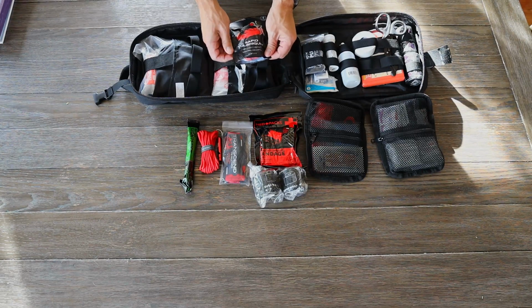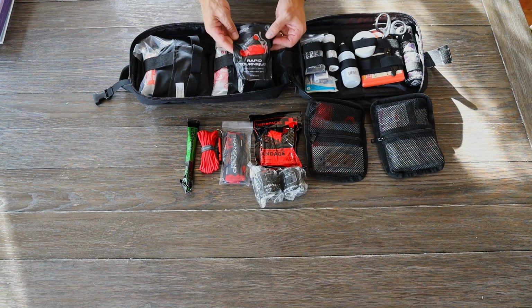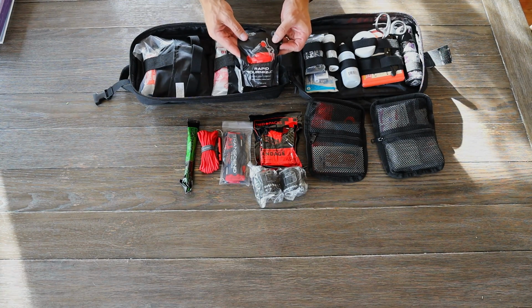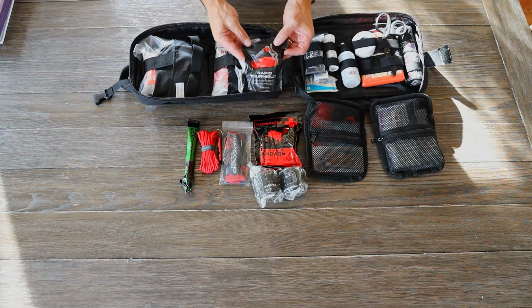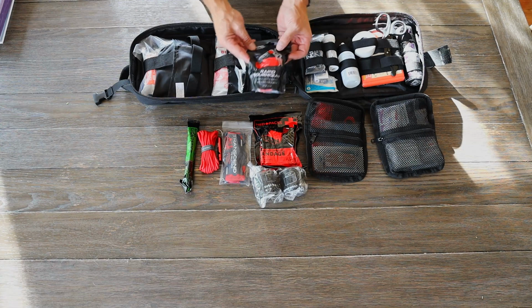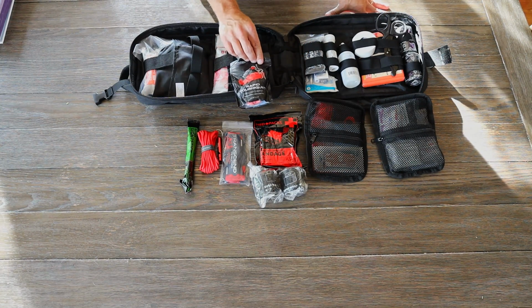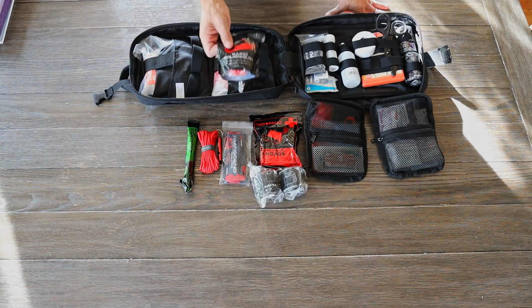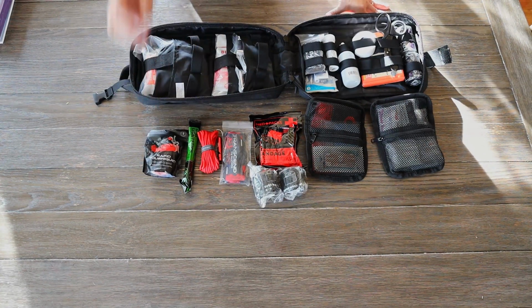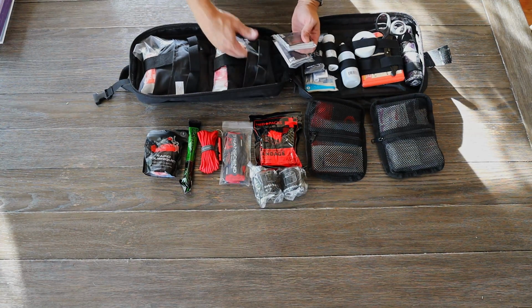Rapid tourniquet. There are several different types of tourniquets that you can use. These are a good thing to use based on what you're trained on. I wouldn't just use any tourniquet without some kind of knowledge of how it works and why it works the way it does. So me personally, I've been trained on the CAT tourniquet, so I don't really know which tourniquet is better or not, but I've been trained on the CAT, so I'm more likely to use the CAT than something like this.